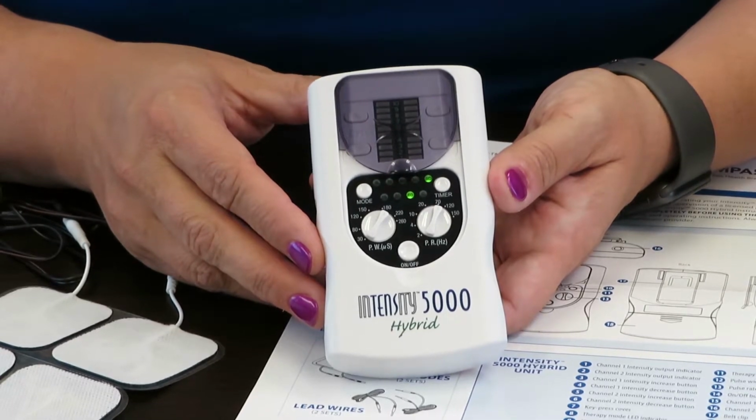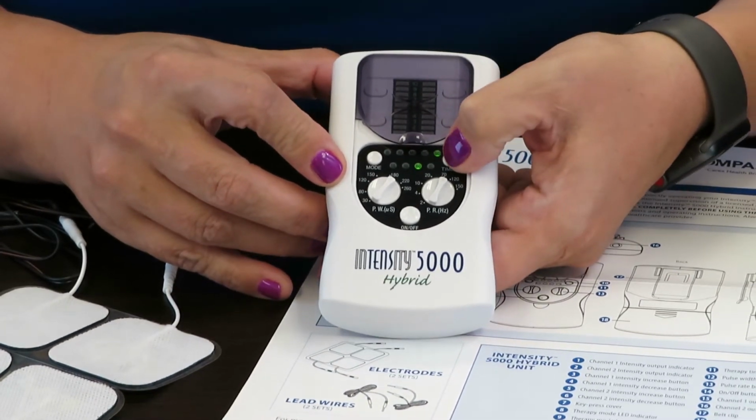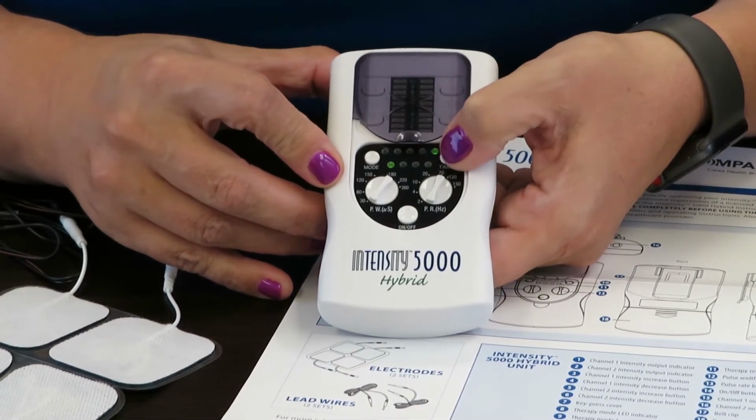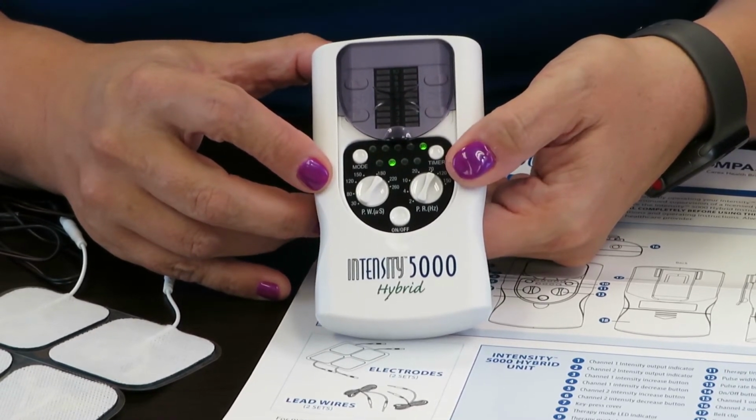There are 4 therapy times available: 15 minutes, 30 minutes, 60 minutes, or continuous. You adjust those here with this button, and you can toggle between the time selections. Your doctor will tell you what amount of time you should use the device.